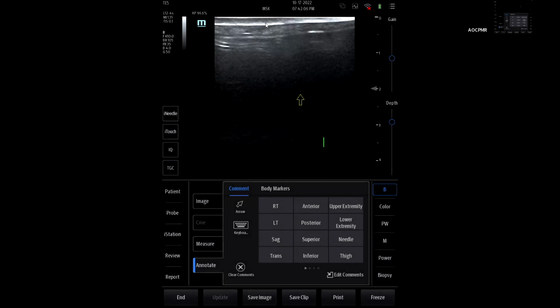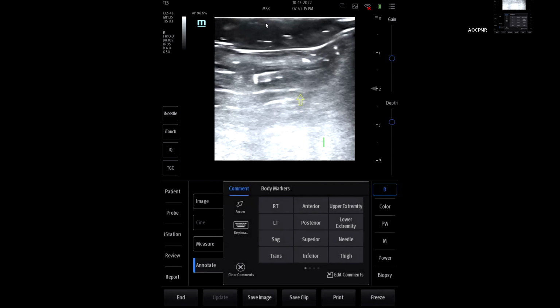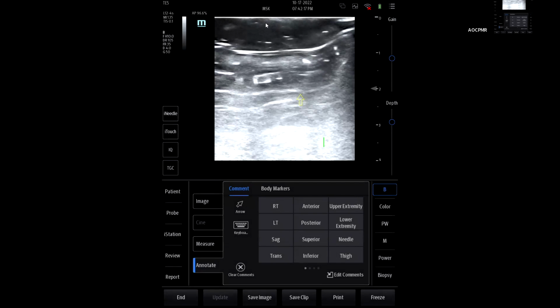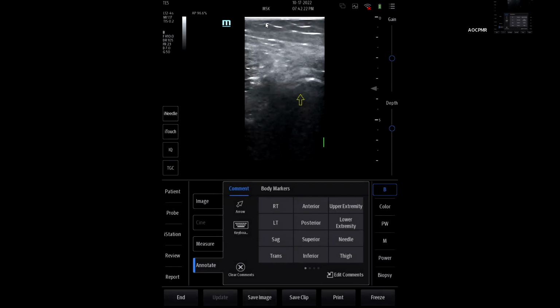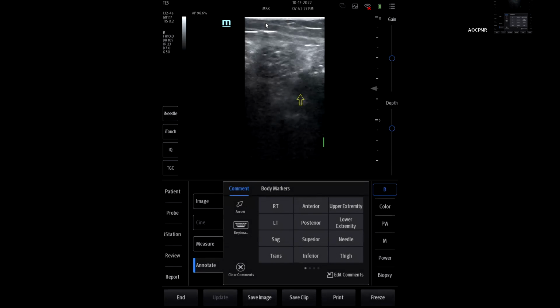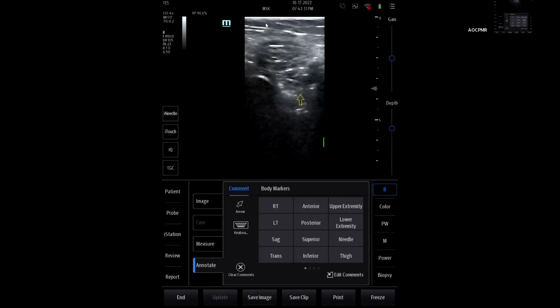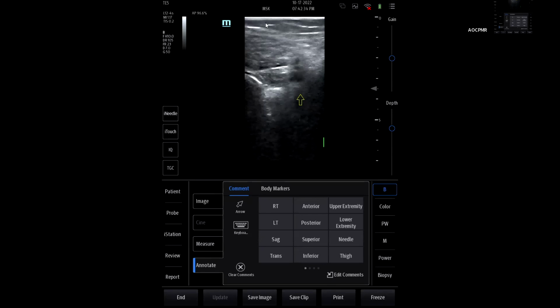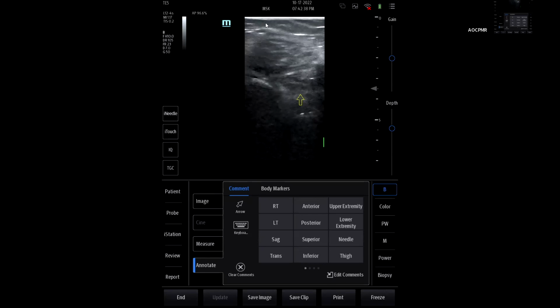Okay, so now I'm having the patient lie prone. I am going to have the probe placed so the left side of the screen is oriented medially, and this is in short axis. I'm going to increase the depth over here. I'm going to start inferior, move superior, and you can see on the right side of the screen, those are our 2 femoral condyles. Do you see that? 1 with the hyaline cartilage there, 2.